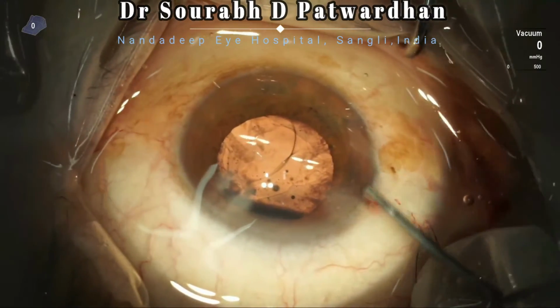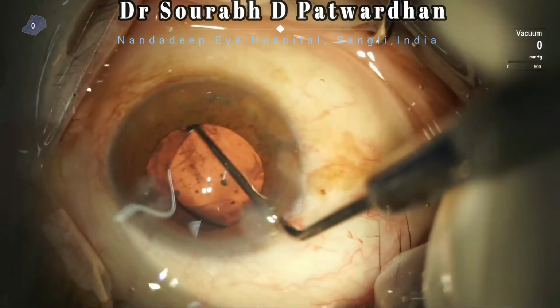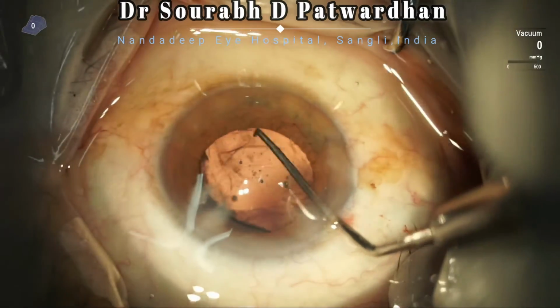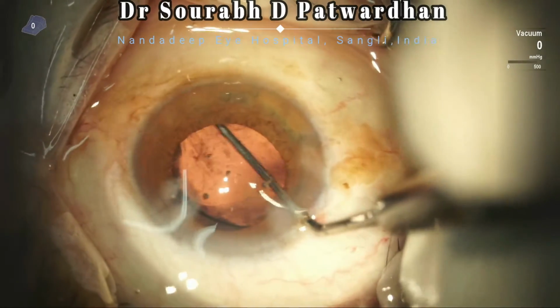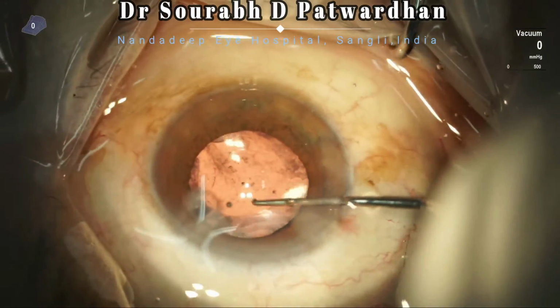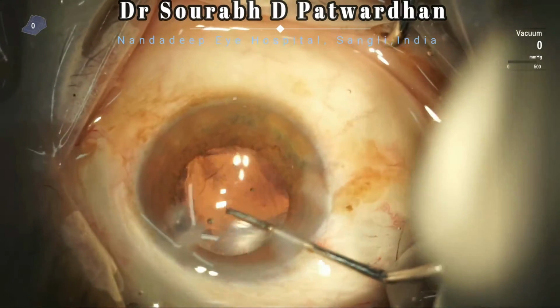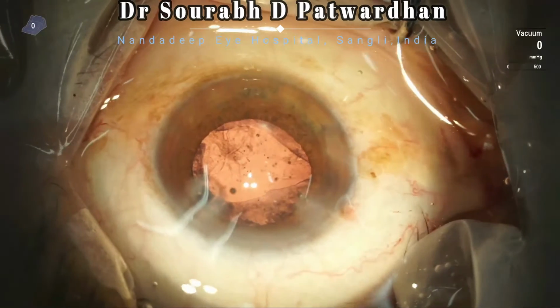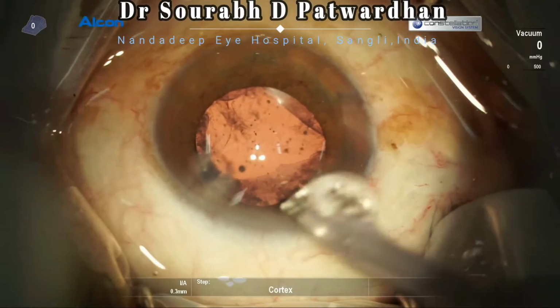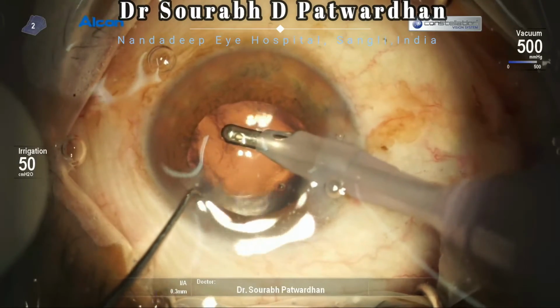So I have placed the lens in the bag and I will carefully maneuver it into its position. In this maneuver, you have to be very careful that you don't pull out the capsular tags again. See how carefully I am managing it. No hasty movements at all, no forceful movements at all, and I just rotated it to my desired position, which is perpendicular to the torn capsule.